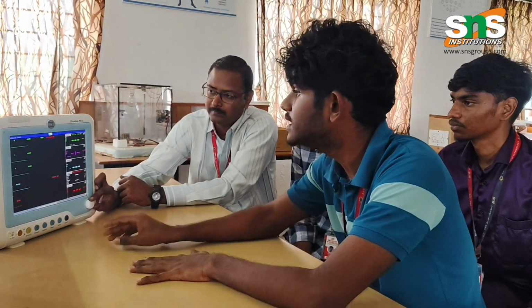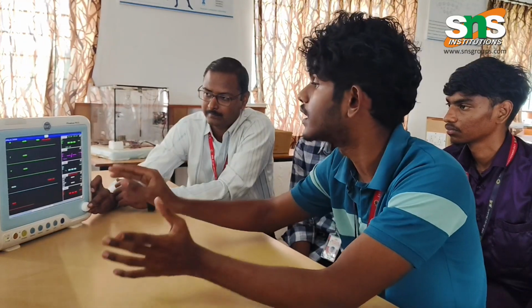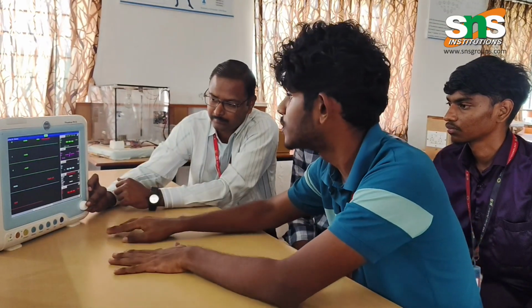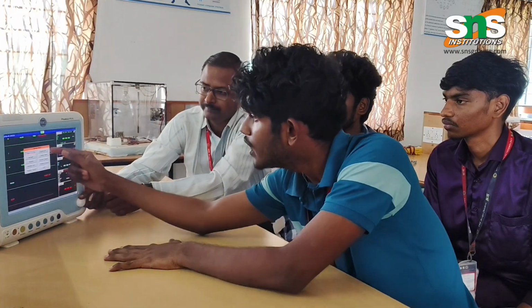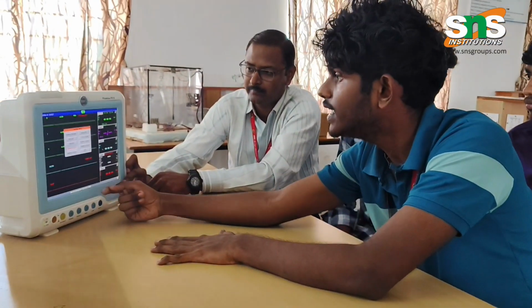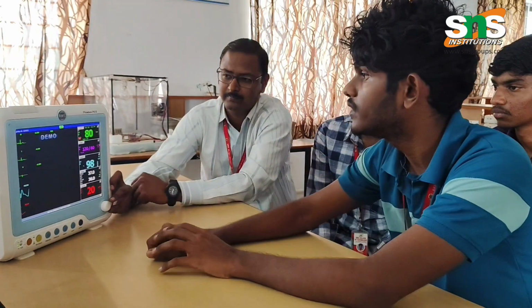To know about the ECG and go through the settings, we first open the demo model, where we can see the ECG waveforms. So we are going with the demo model. Here in the menu, we have plenty of options, right? In that, we have the demo model here. So we are going with it.